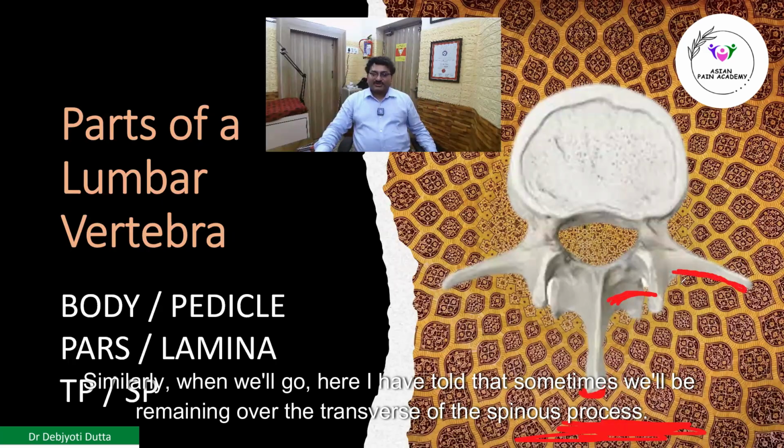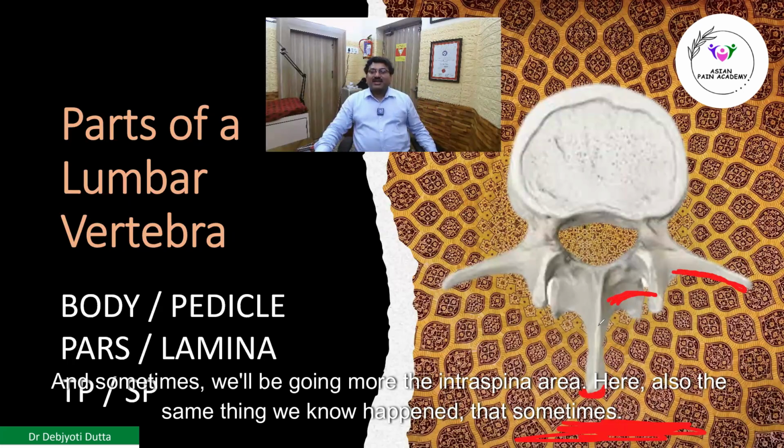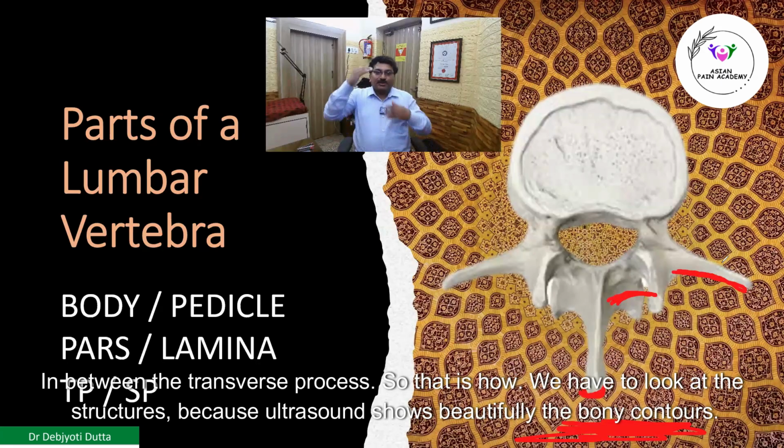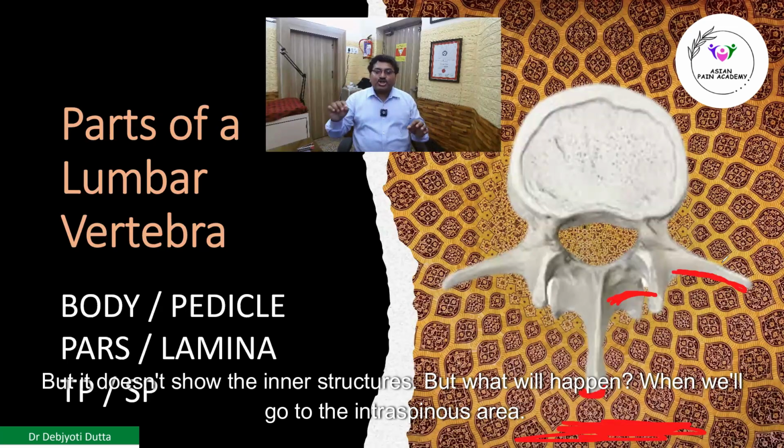Similarly, when we go here, as I have told, sometimes we'll be over the spinous process, and sometimes we'll be over the interspinous area. Here also the same thing will happen, that when we are scanning up and down from the posterior side, sometimes we'll be over the transverse process, and sometimes over the intertransverse space in between the transverse processes. So that is how we have to look at the structures, because ultrasound shows beautifully the bony contours, but it doesn't show the inner structures.